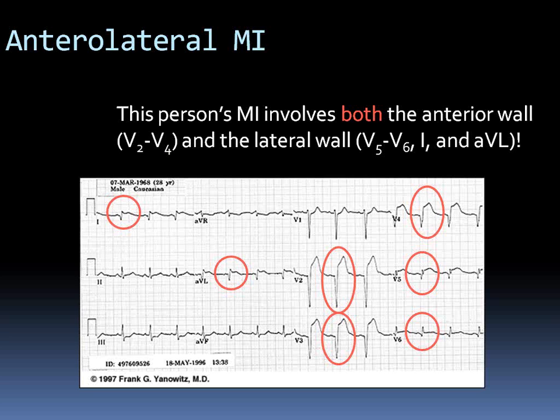Because that's what all cardiac rehab and ACLS is about. You know, rhythm recognition, diagnosing acute MIs, diagnosing if someone is in heart block, and diagnosing if somebody is having a VT or a VF. The treatment of it is, of course, a separate part of ACLS, but my job to teach you guys is rhythm recognition and ECG recognition of MIs and arrhythmias. Which arrhythmia you guys are not clear with, and we can go over it again.